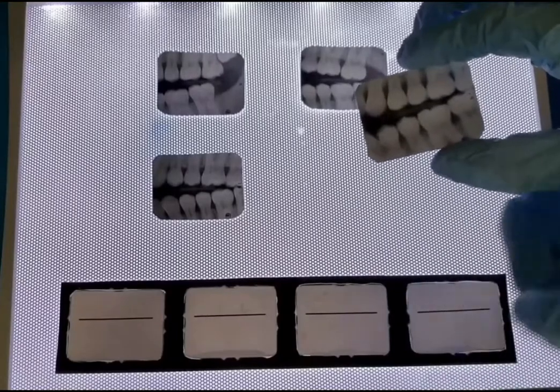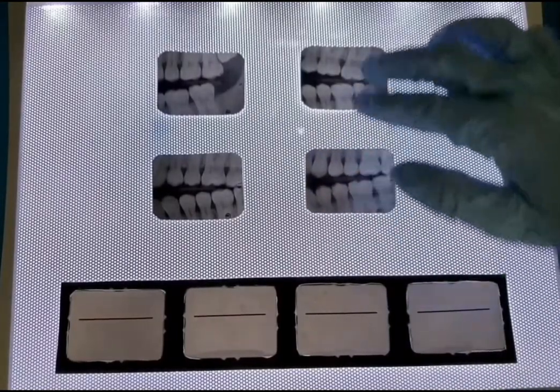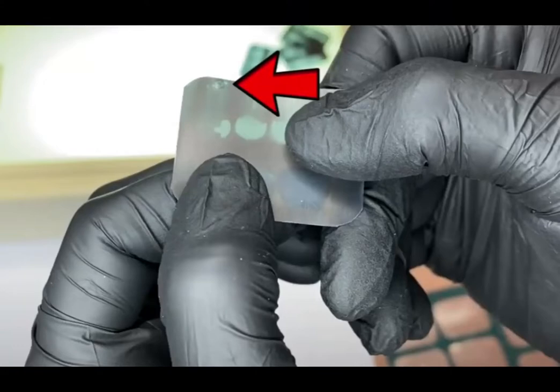Place the embossed identification dot the same way for all films. As mentioned before, make sure the embossed dot is convex.